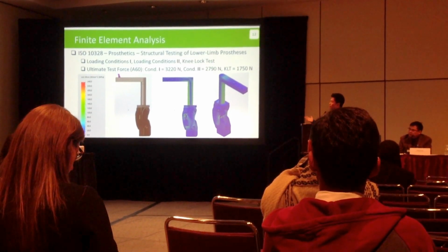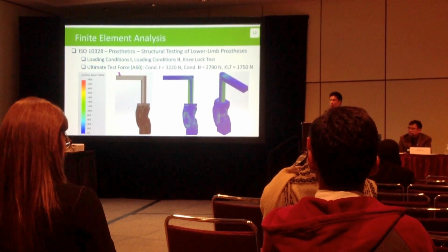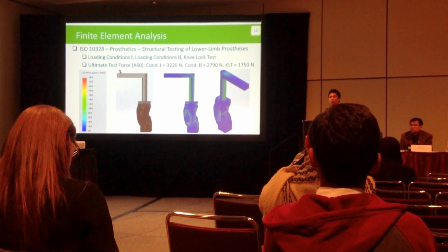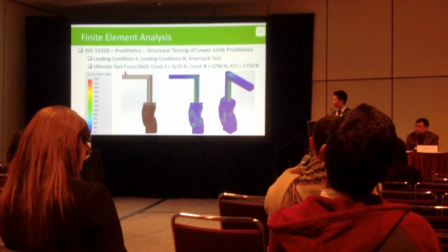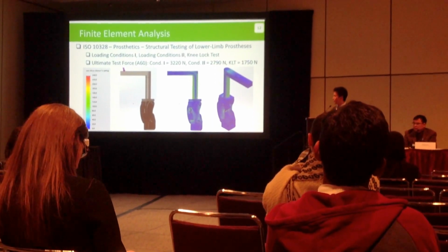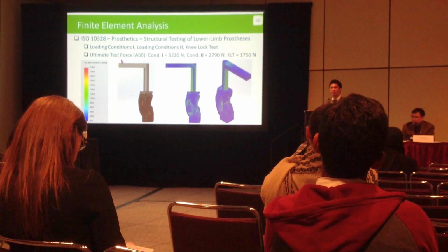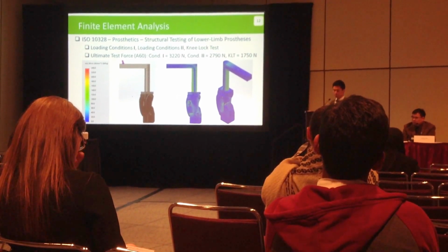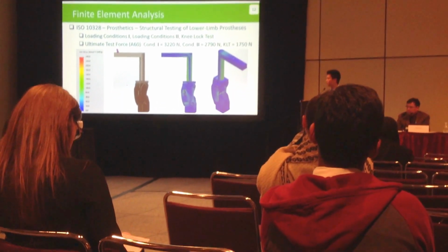After all the testing and optimization, the knee right now can support a 60 kilogram user, instead of the goal of 45 kilograms. Now it can support 60 kilograms, and the safety factor is about 5. In stage 2, we're going to put it to the test and see whether it's true or not.